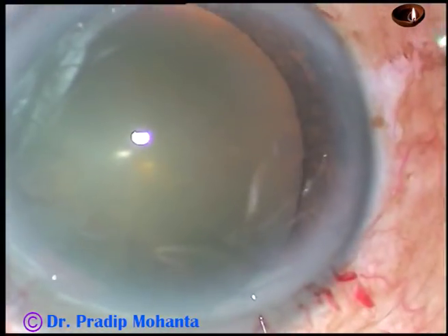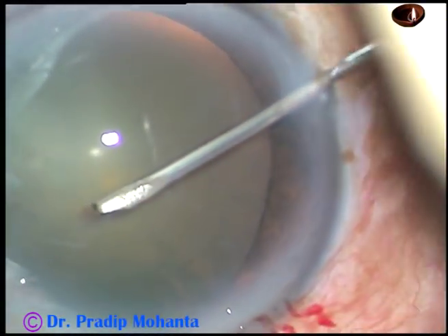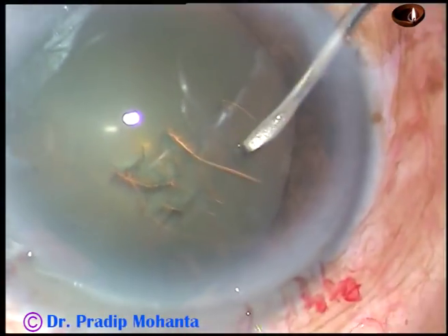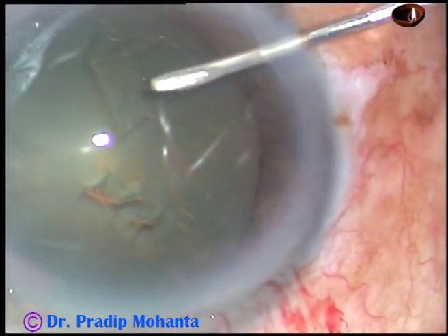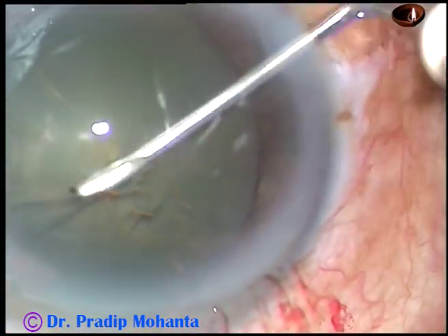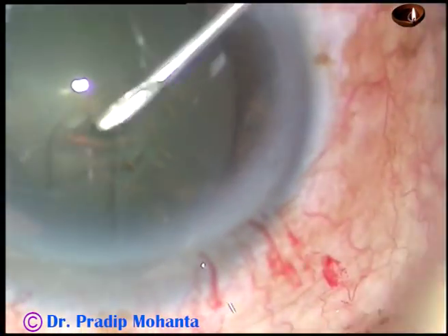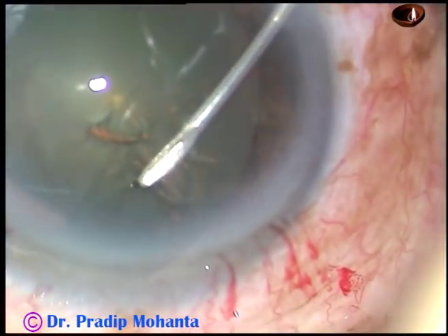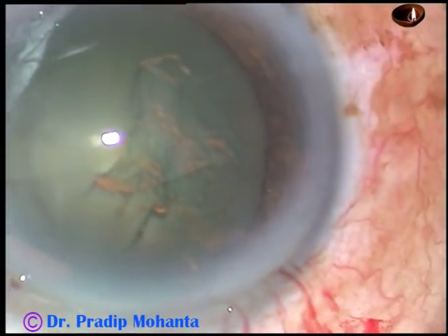And now, take a 26-gauge disposable needle cystitome. Incise the capsule and raise a big flap. Flip this flap and guide this flap all around. Be at a certain distance away from the zonular fibers, and you will achieve a round rhexis. That's it — capsulorhexis is done.